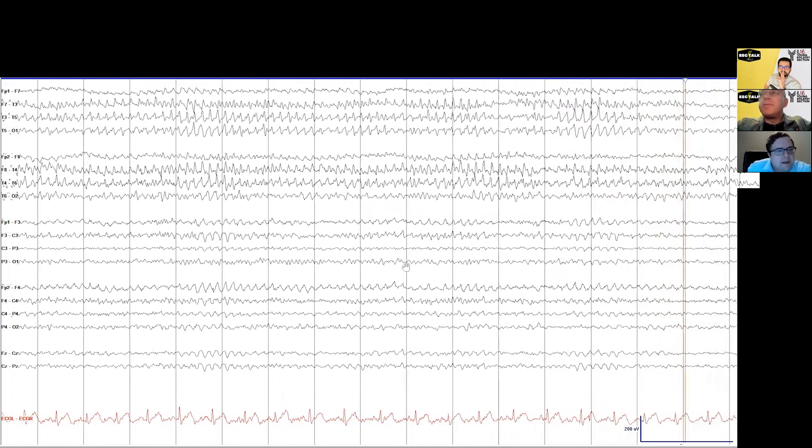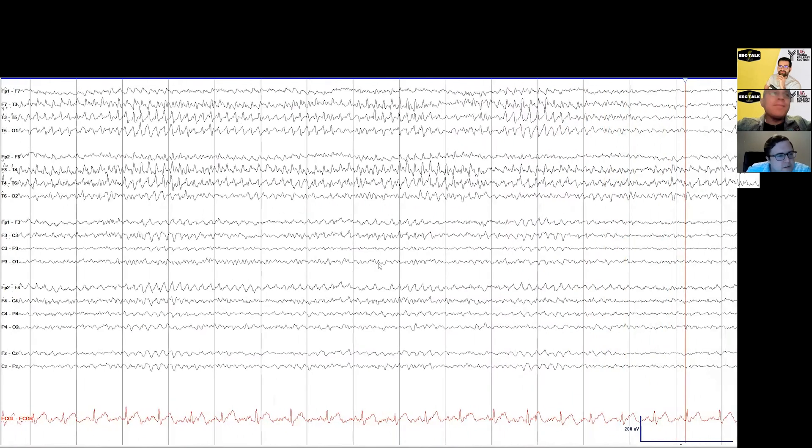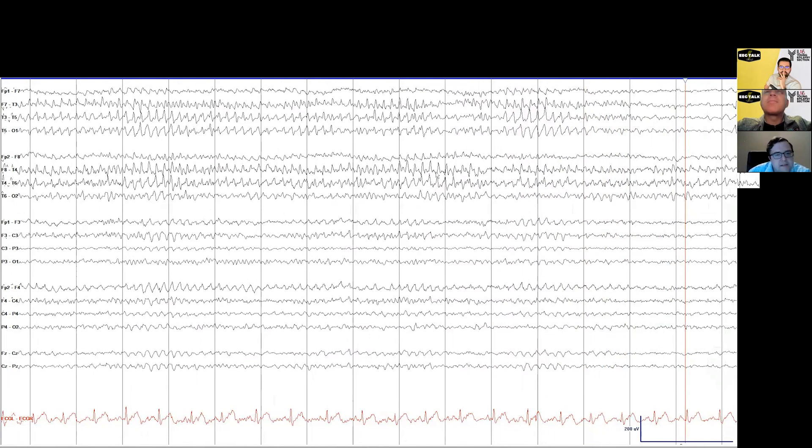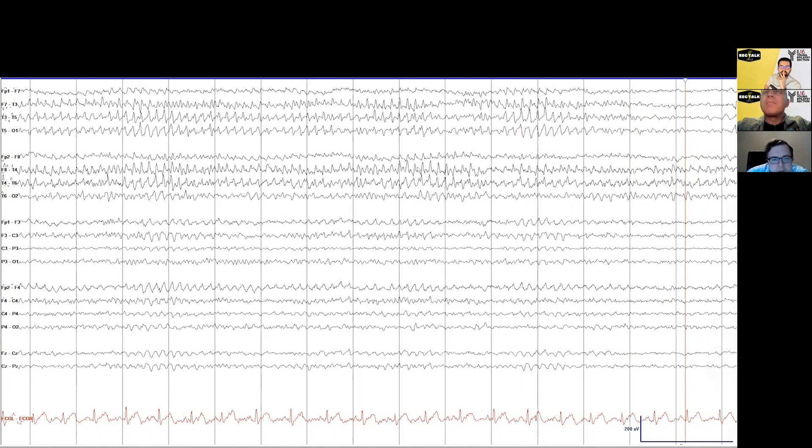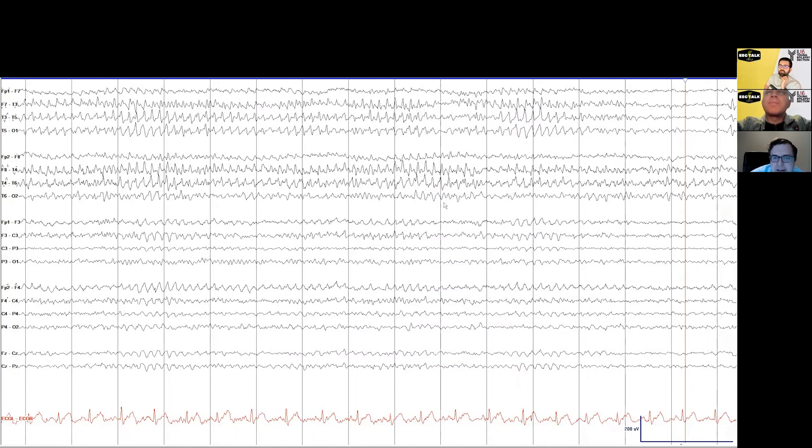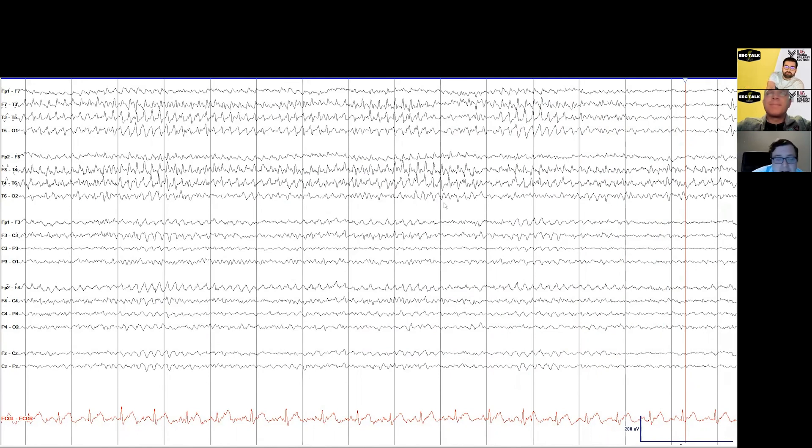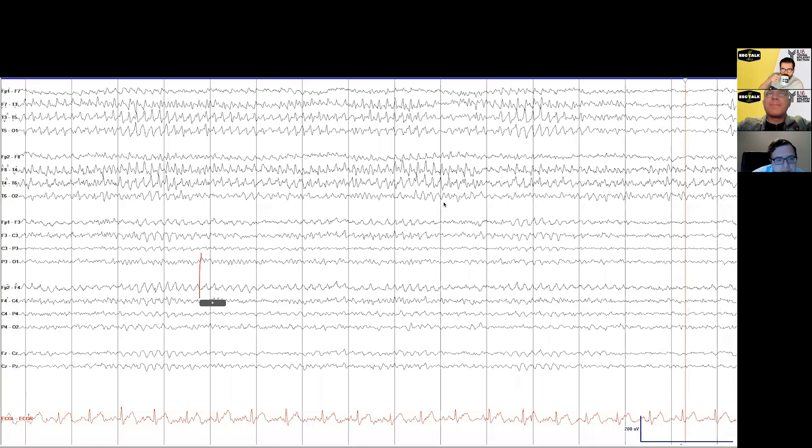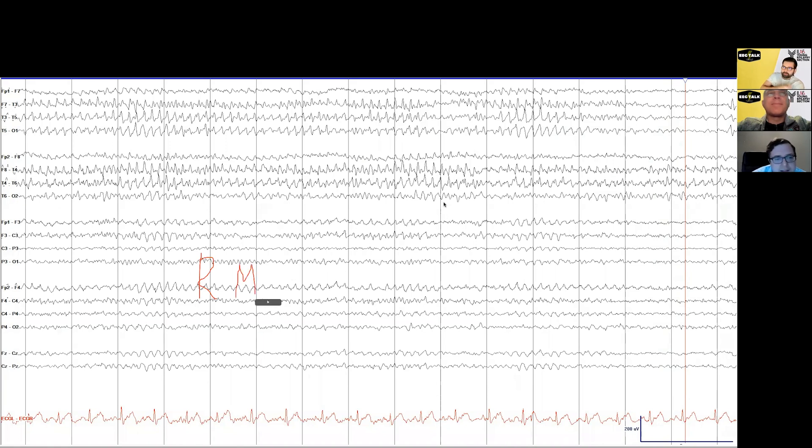You see that, Dan? Yeah, so you see this nice little notched appearance you got going on there. It looks like you have a theta rhythm, about six-ish hertz, with an overriding maybe alpha to make it look that notched way. That's pretty classic of a normal variant that is exactly how its name sounds and I think describes this pretty good. So like you said, it looks pretty rhythmic, right over the mid-temporal regions, bilateral in this case, and we said it was theta rhythm. And you said at the beginning the patient's drowsy, and that's exactly the name of this normal variant: Rhythmic Mid-Temporal Theta of Drowsiness.